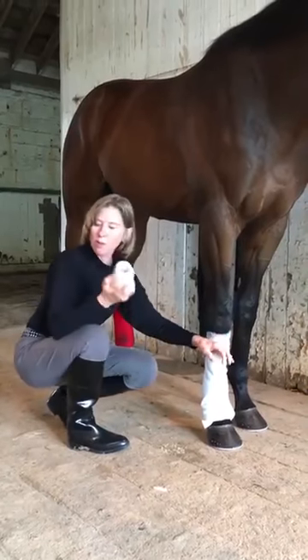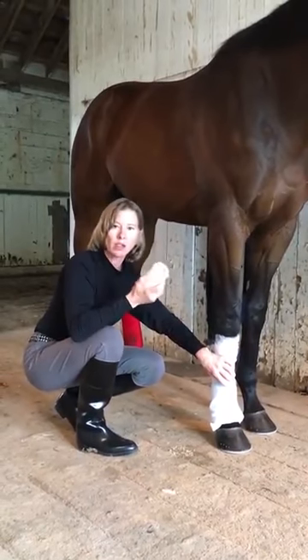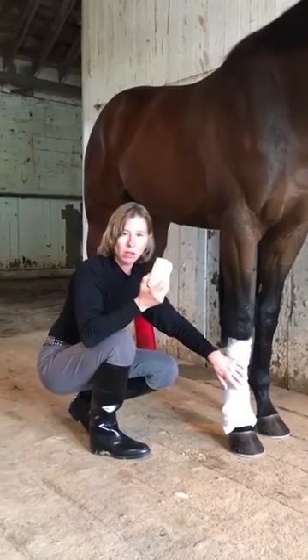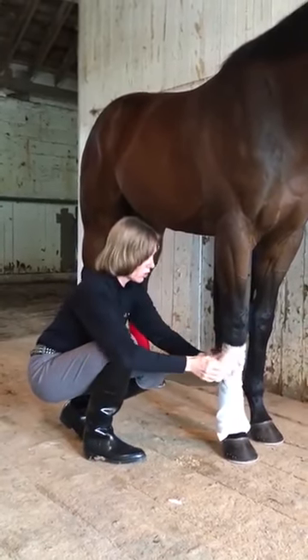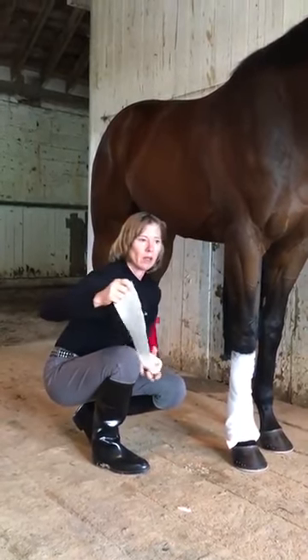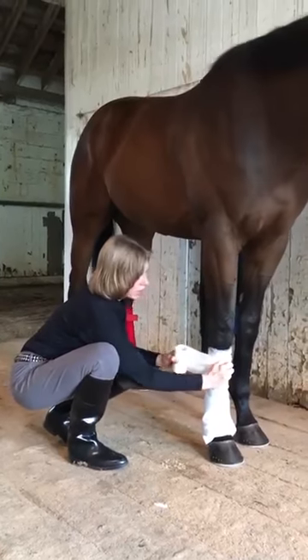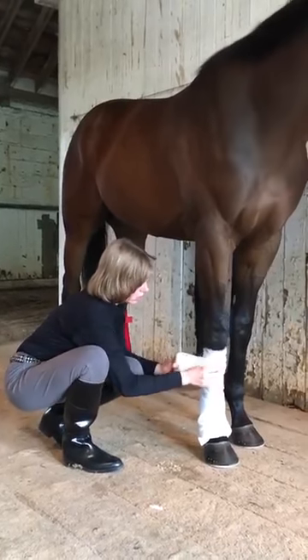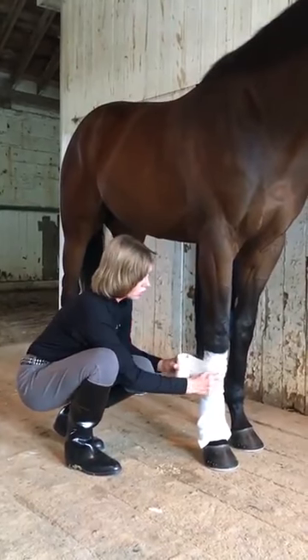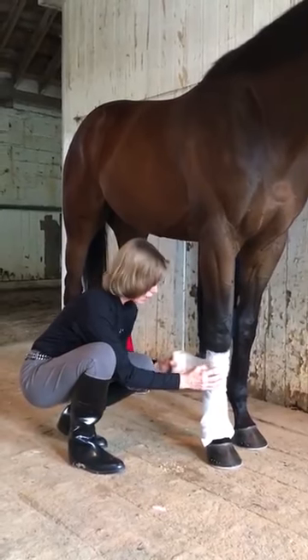This is the vet wrap — it's wrapped in plastic. If it's not wrapped in plastic it might be a little dried out, so be careful. Don't use an old vet wrap; make sure it's new and fresh. The vet wrap is very flexible, almost spongy. You always want to start on the cannon bone — that way the horse doesn't feel any bulk underneath where you wrap it, so you always start in the middle of the cannon bone.